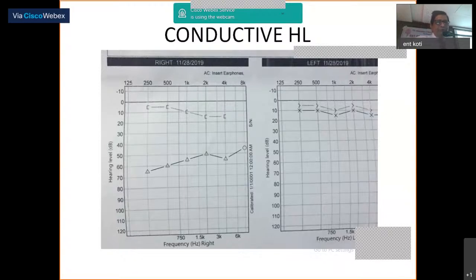Okay. So now, here in decibel, it is a negative logarithm. As the degree worsens, the audiogram air conduction will keep coming down. On the left side, you will see a normal ear in which air conduction and bone conduction, even though they are normal, you see the way they are depicted. Either they overlap or air conduction is always below, it cannot be more. If you get a recording more than 0, minus 10 or minus 20, what do you call that ear? An ear which is much more sensitive, hyperacusis, which is very rare. So you need not remember about that.